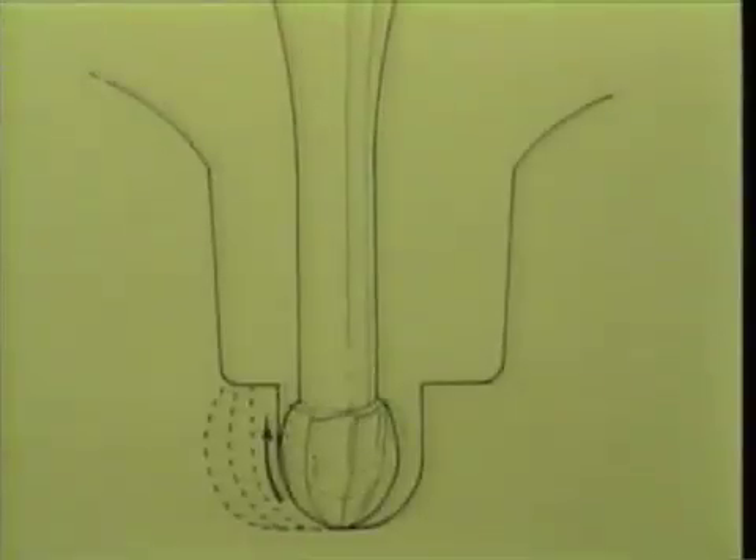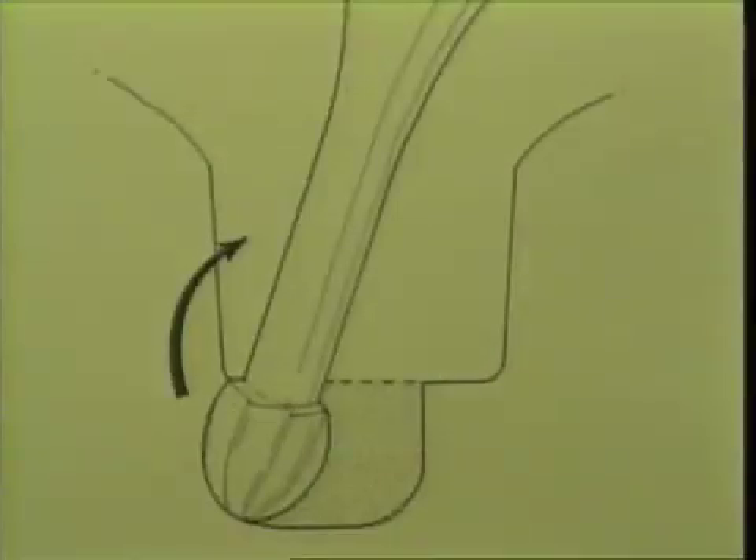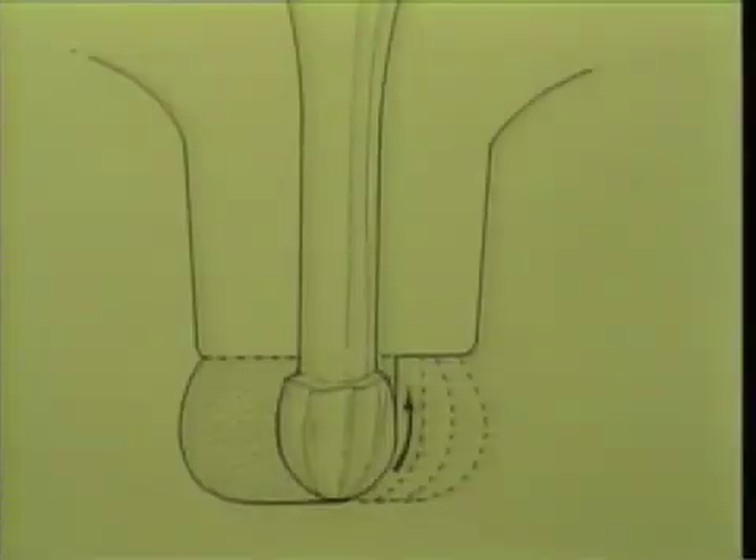With the handpiece running at high speed, the burr is reseated into the established cervical extension of the initial penetration. Contacting this area of the tooth structure without cutting cervically, the burr is moved in a buccal direction, approximately one-half a burr width at a time, and then withdrawn. This procedure is repeated two or three times until proper extension is accomplished.